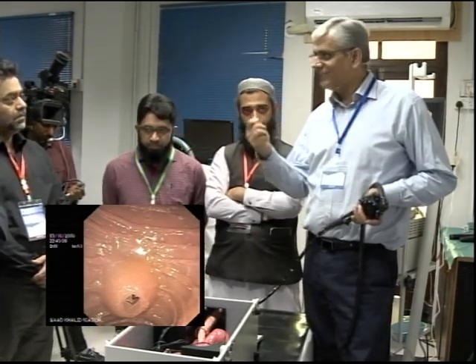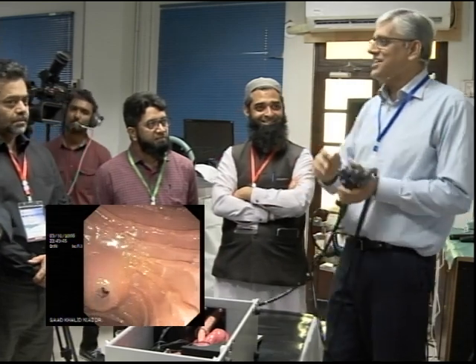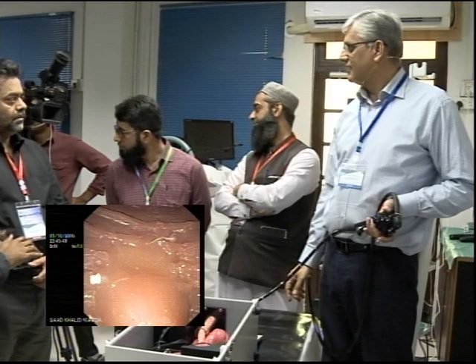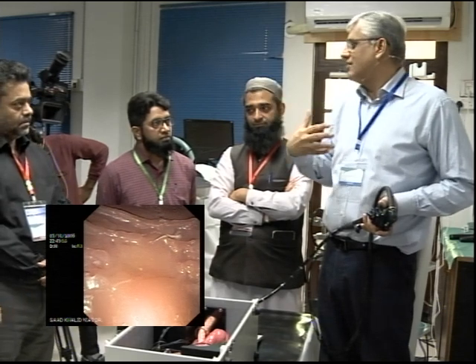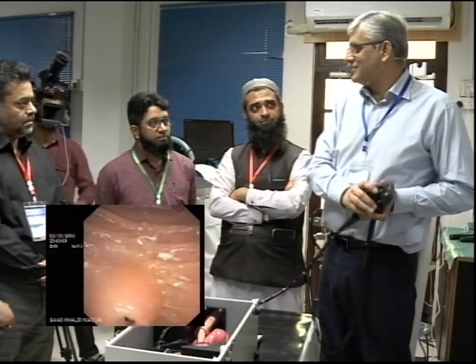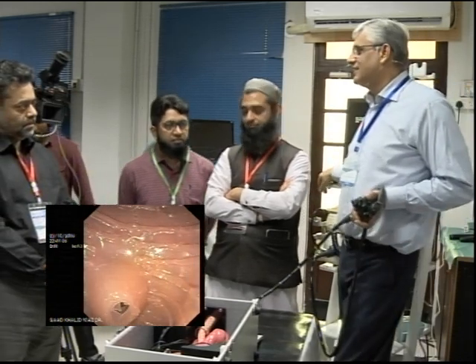Because you will forget. You think, I've done my sphincterotomy, fantastic, the stone also came out, and you just completely forget and pull it back. There is no harm. What he's talking about is comfort level, and I agree with him because my comfort is also when I can move things. Yes, so manipulate. But that comfort has come over years. What you people are saying is for the initial stage.